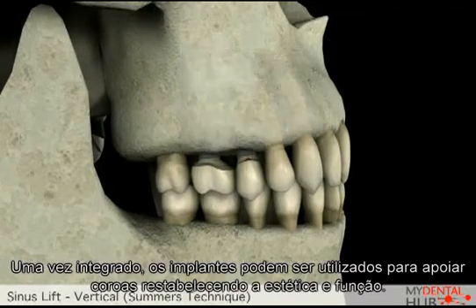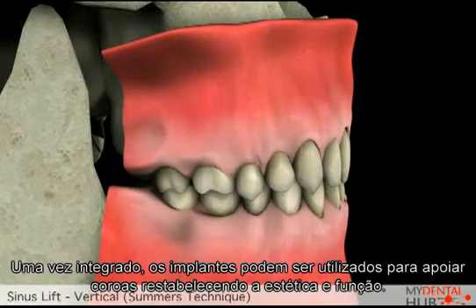Once healed, the implants can be restored with posts and crowns to create both functional and aesthetic restorations.